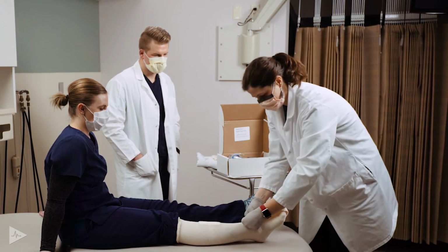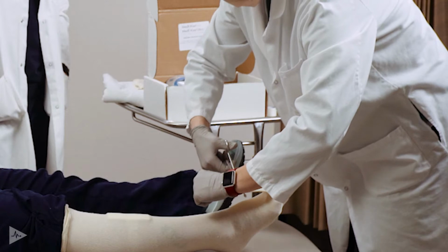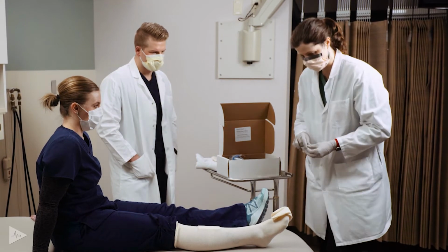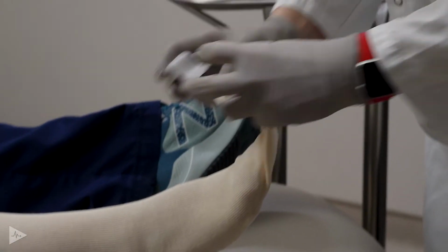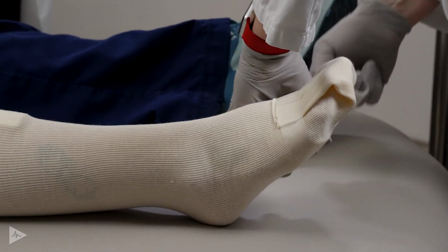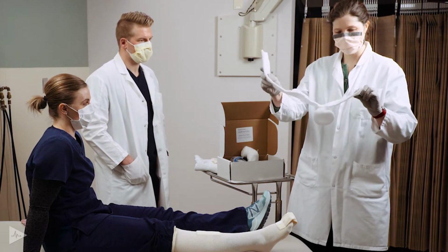And then if you have excess coming further back onto the foot and ankle area, that can be trimmed. It will land at about the midfoot. The kit also will include a set of plastic tape, and you can use that to secure the stocking toe end in place here. You want to keep that loose over the toes. Secure.